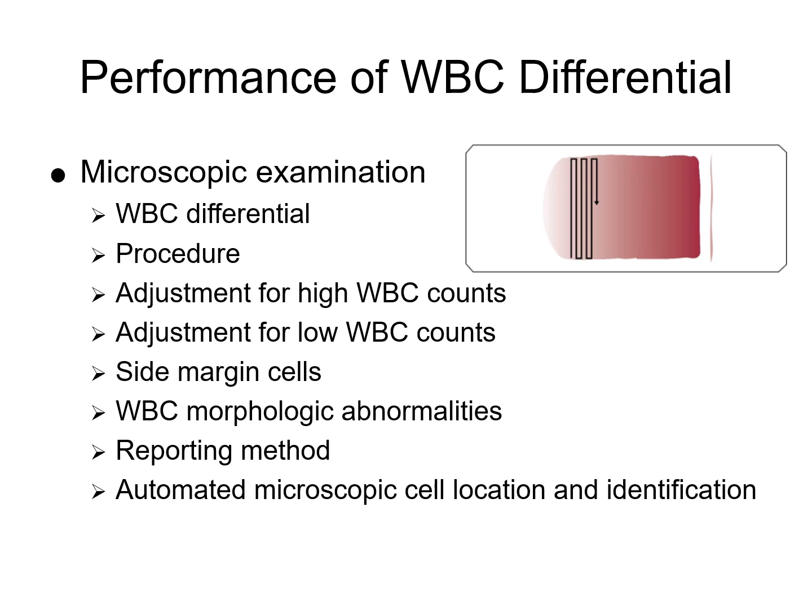For a white blood cell differential, the procedure: the white blood cell differential involves manually counting and classifying usually 100 white blood cells on a peripheral blood smear to identify the white blood cell types and detect any abnormalities. In samples with elevated white blood cell counts, fewer fields may need to be examined to reach the target cell count because there is an abundant amount of white blood cells in the sample. In cases of low white blood cell counts, more fields and slides may need to be reviewed to count enough cells for an accurate differential.